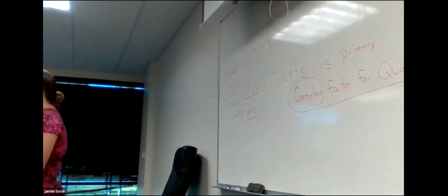So distance. If we increase our distance of our tube, that's inverse square law. Not as many photons are going to make it through the patient. So it's going to decrease our quantity. So an increase in distance decreases our quantity, making it to the IR. Look at the chart. Increase in distance decreases quantity. And these are talking about making it to the IR through the patient. Further away, not as many are going to make it because they're going to spread out more, inverse square law.